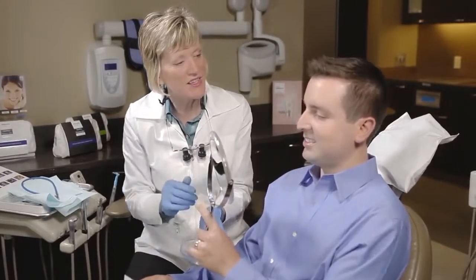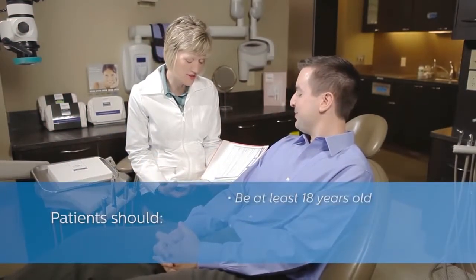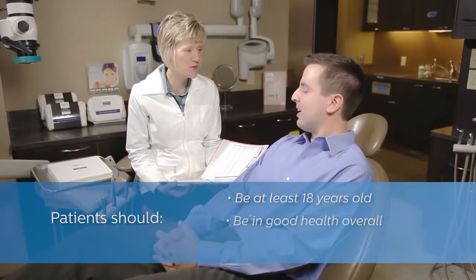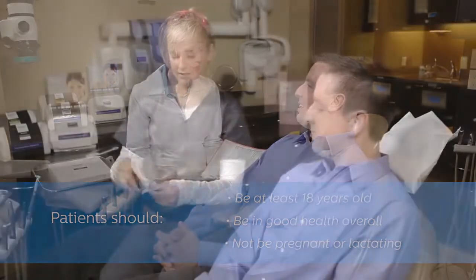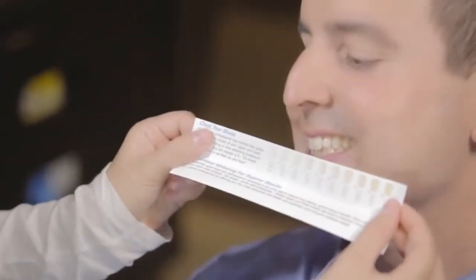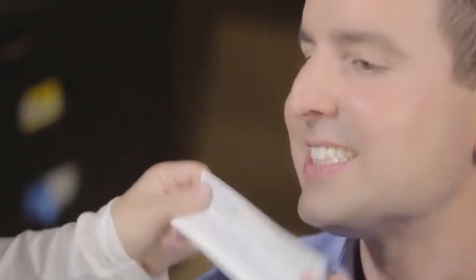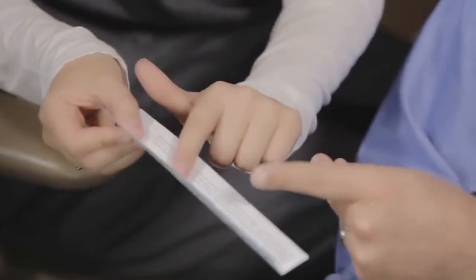Before beginning, it's important to determine if the patient is a candidate for Quick Pro whitening varnish. We recommend that they are at least 18 years of age and in generally good oral condition. Pregnant or lactating mothers or those with a serious illness should consult their medical doctor prior to the treatment. Like all whitening procedures, results may vary from patient to patient. Quick Pro is clinically proven to whiten on average four shades with just a single five-minute chair-side application.